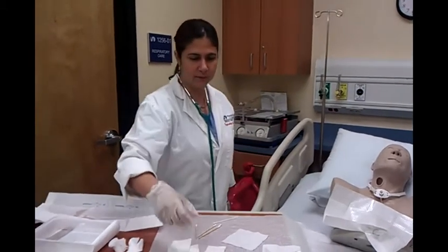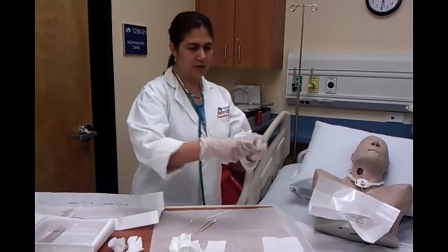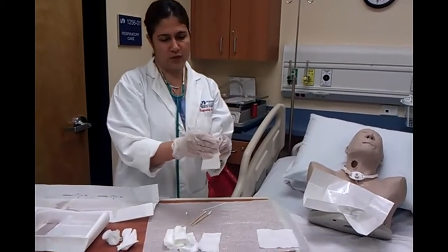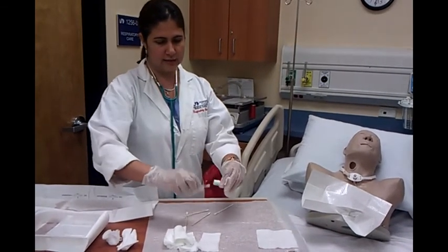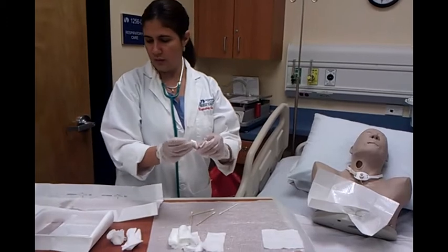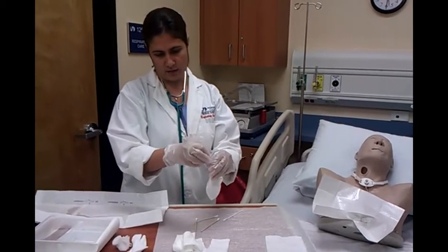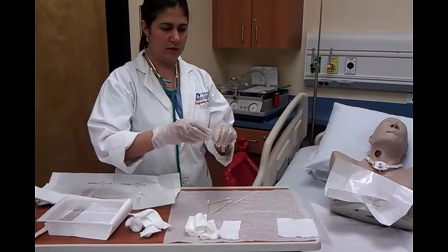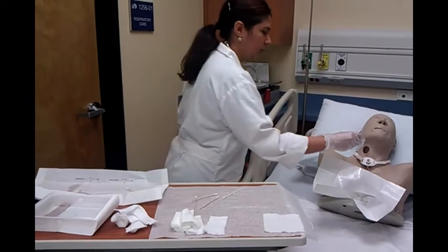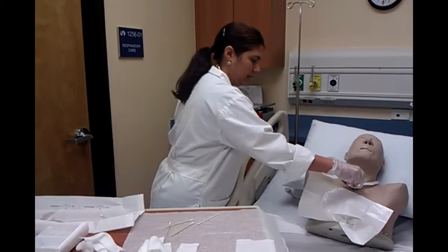After you dry the skin, you get the inner cannula and try to dry outside and inside with the little brush. And put it back. You have to put it back, turn it, and clip it.